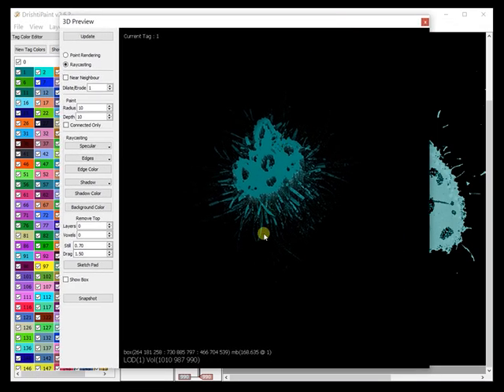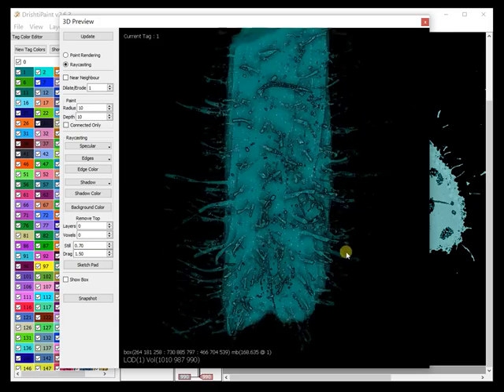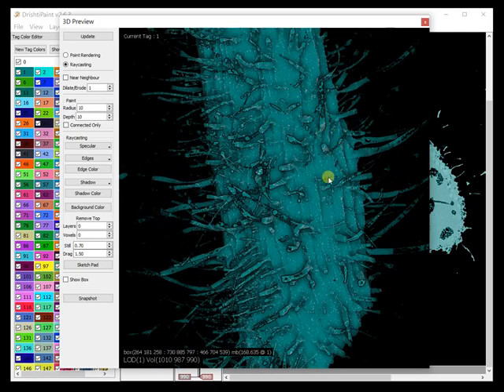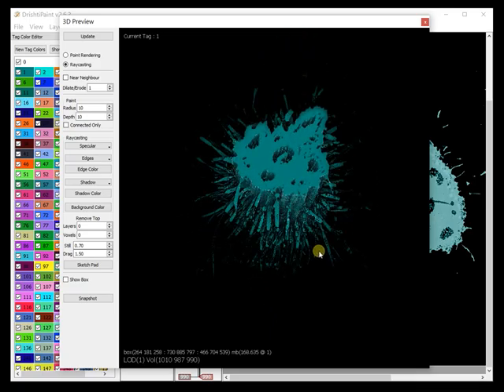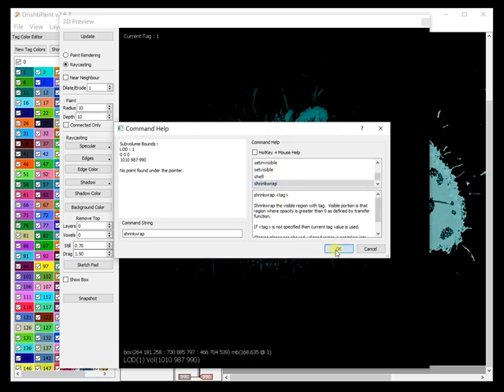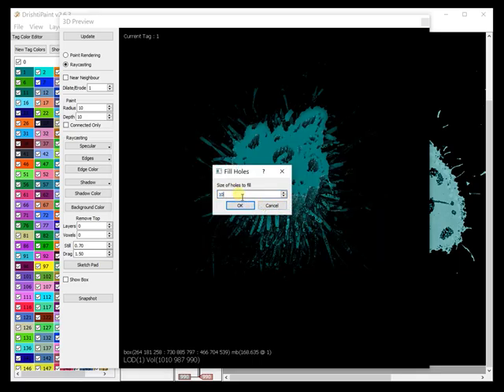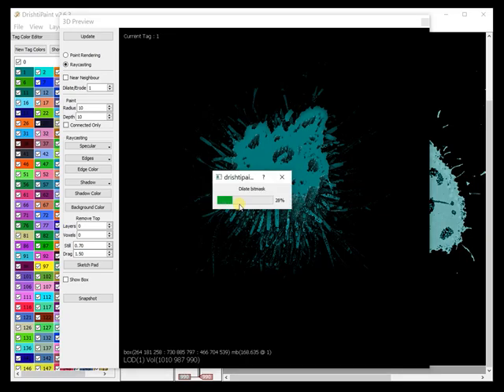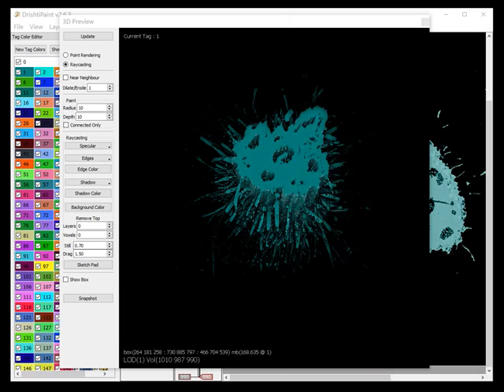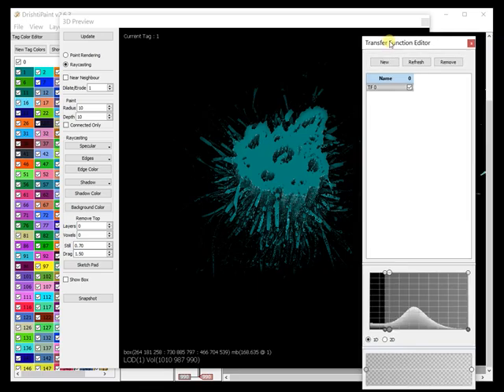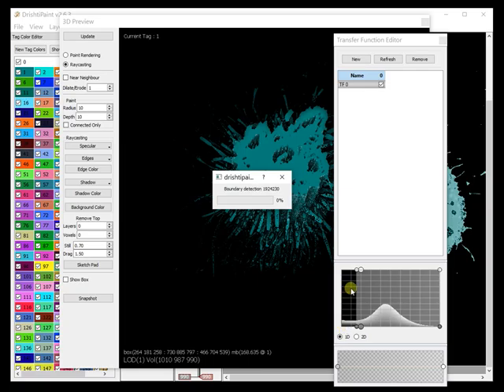These are probably tiny holes somewhere in here where the flood fill is escaping. Let's again apply the shrink wrap and this time we will give some bigger holes to fill. Another option is to just increase this transfer function so that it catches most of the area that we are interested in. This will plug all these smaller holes.